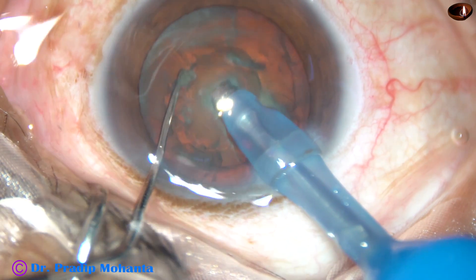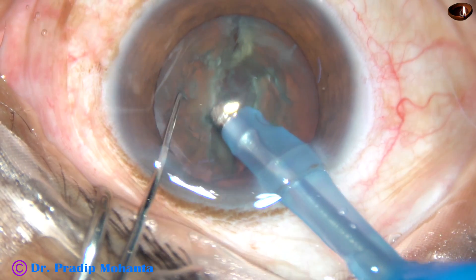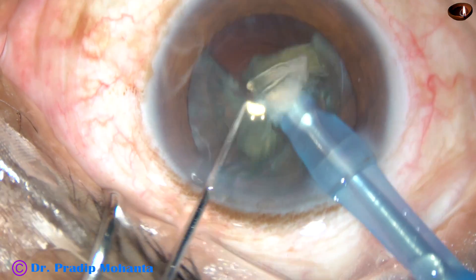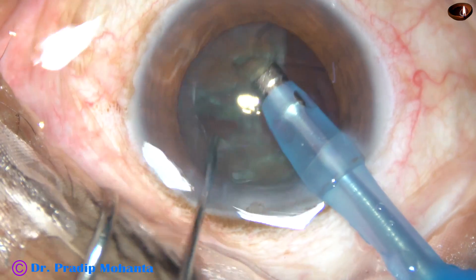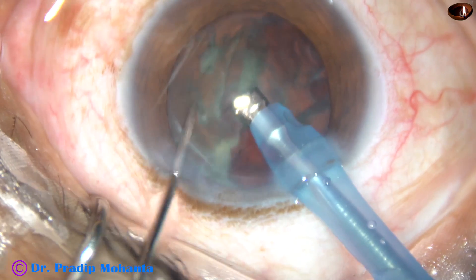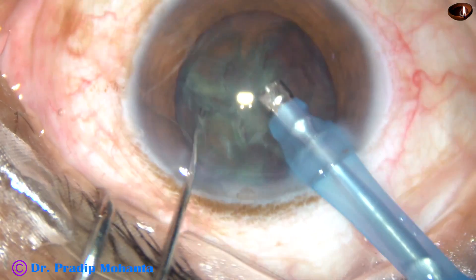Bury the tip into the substance of the nucleus. Hold the nucleus firmly and then chop it. Hold it at another place and chop it again. One nuclear fragment has become free and I have emulsified that nuclear fragment. Now I tried to emulsify this piece but could only do it partially because the fragment was attached to the other heminucleus.